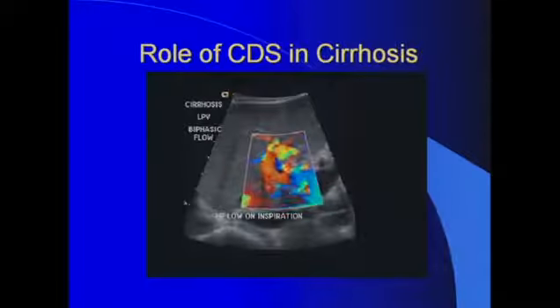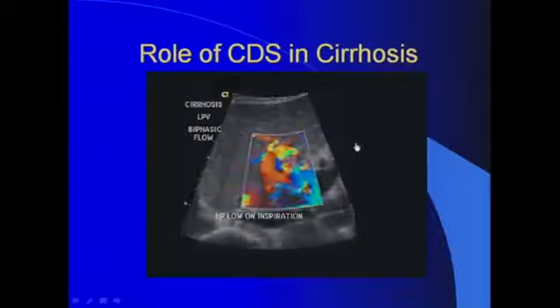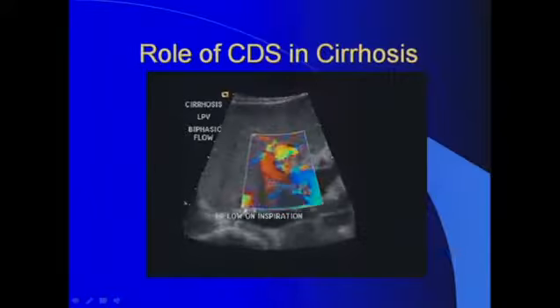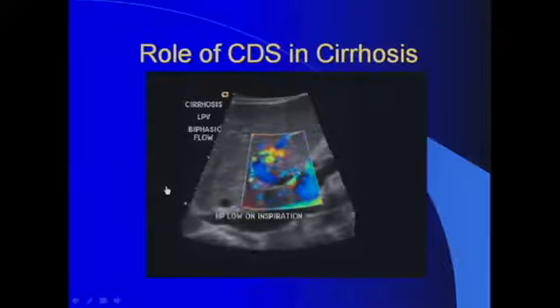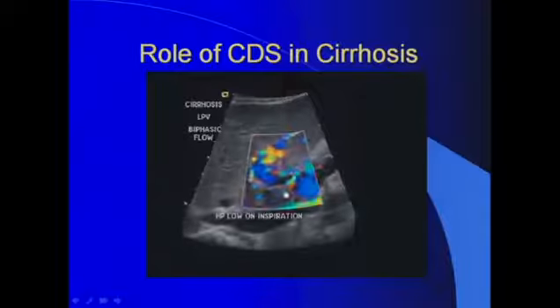So let's review some of these images and video clips. I really recommend that evaluation of this physiology be performed in real time using video clips or by personally scanning the patient in real time, to make sure you evaluate the blood flow to the liver, the portal vein, and the hepatic artery.